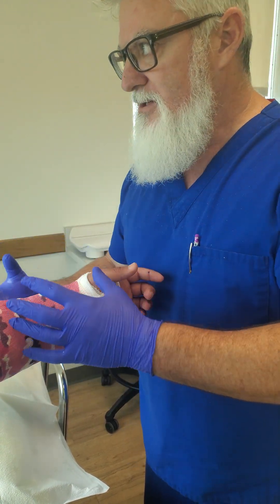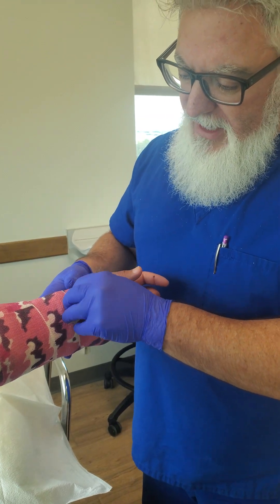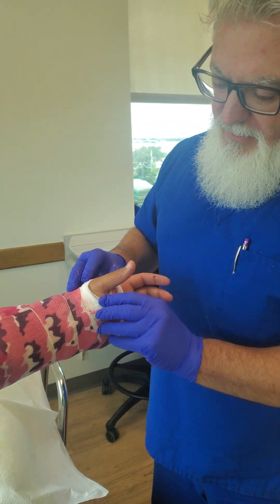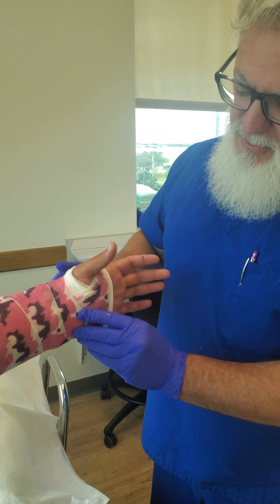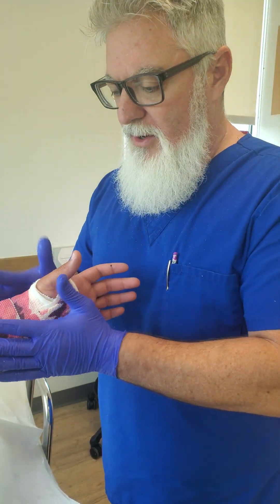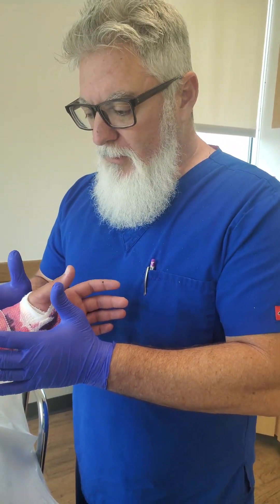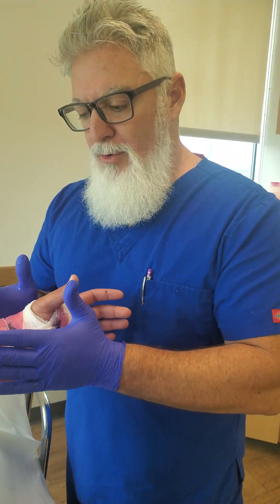You know that you can't put the cast on tight, and you want to make sure that the edges are nice and soft. You want to make sure that they have full range of motion for their thumb and fingers, and the distal edges are soft as well, going below the palm crease. These are all the things we know and all the things that are in the textbooks.